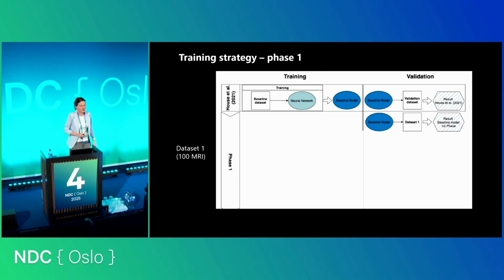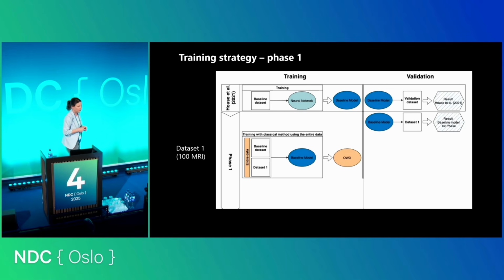In the first step, we are just taking the model that we trained before, and we are evaluating the results. Later, we had 2 training strategies. The first of them means that we wanted to compare what if we kept the data for some time. We had, of course, the permissions to do that. But we wanted to be sure if the models would be better, worse, or if there would be any significant changes.